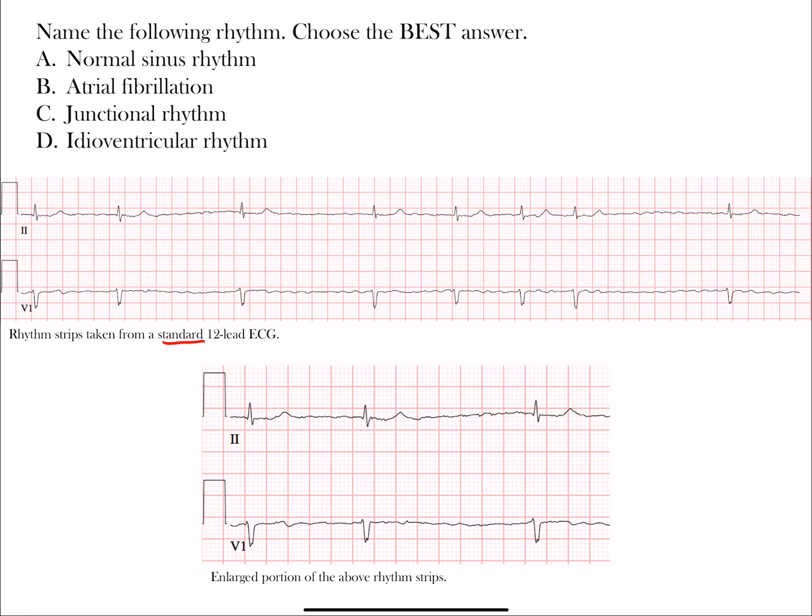You have rhythm strips taken from the standard 12-lead ECG — lead II and lead V1. Lead II and V1 are the best leads to look for atrial abnormalities in the P wave. Lead II is an inferior limb lead at positive 60 degrees in the frontal plane, and V1 is the right precordial lead giving a short-axis view of the heart.